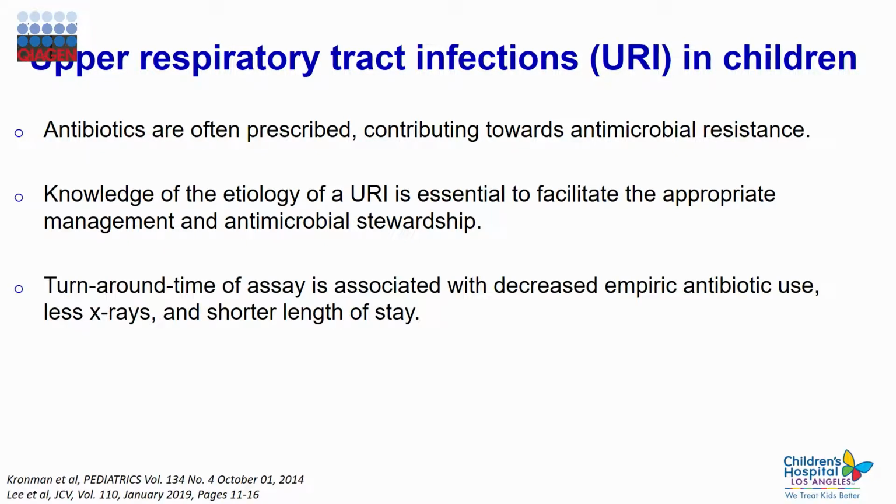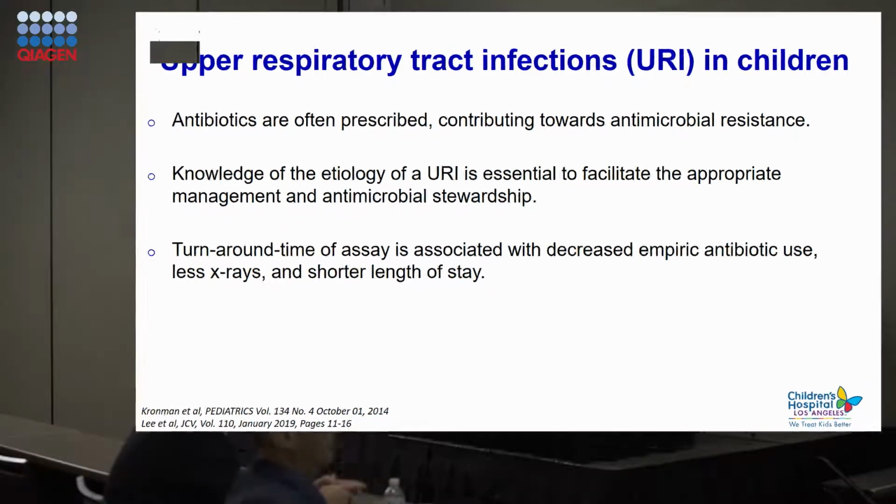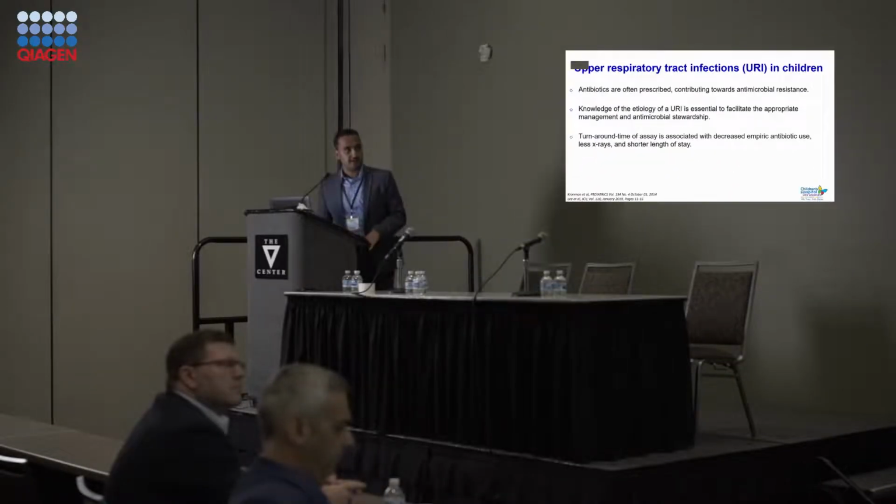And what's also important is the duration of the time from collection of the specimen to results. So the turnaround time of the assay is associated with decreased empiric antibiotic use, less exposure to x-rays, and shorter length of stay in a healthcare facility in general.